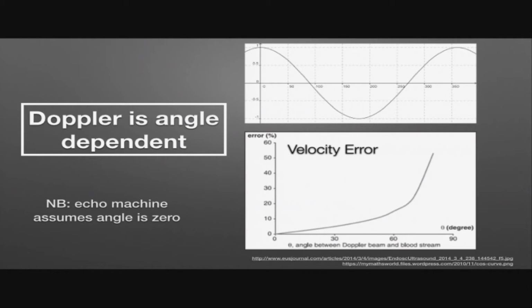If you have theta up at close to 90 degrees, cosine is 0. And that's why, again, as we said, that we cannot pick up the movement of a structure if it's at 90 degrees to us or perpendicular, because that's 0. That means cosine is 0, so you can't detect any movement based on the Doppler equation.